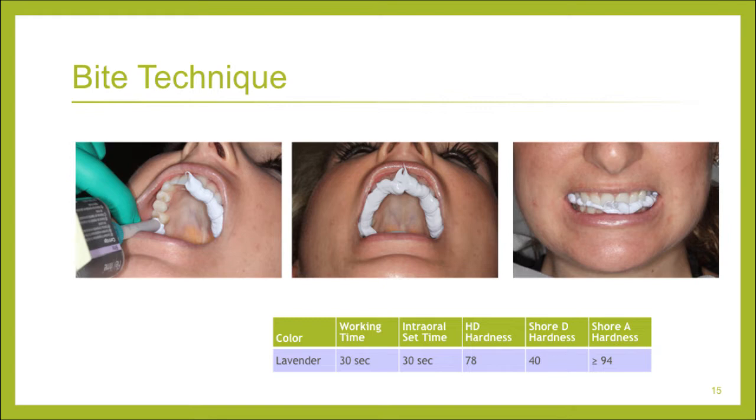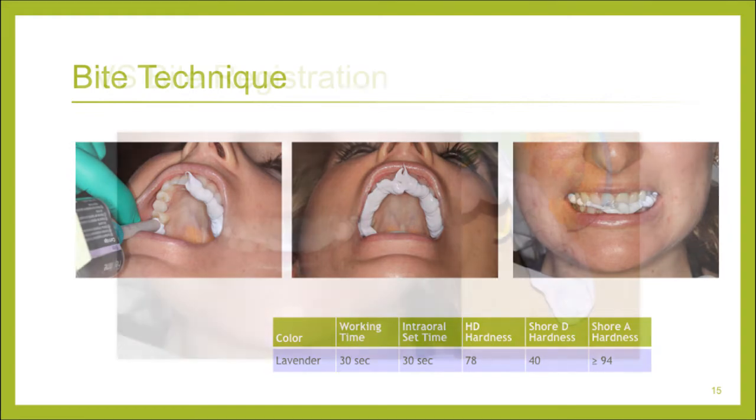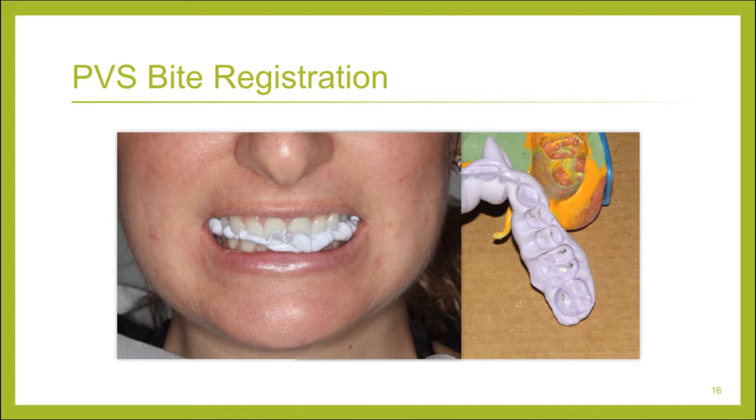And the way that we do this is a little bit different than probably what you've seen before. We'll take the impression, but we're going to start on the maxillary arch. And I learned this from a really good friend of mine, Dr. Cappy Sinclair. He said to me, Shannon, if you take the maxillary bite, place that material, start on the last molar and go to the midline. But again, it's different. Do it on the maxillary arch and have the patient bite together. You won't have as many discrepancies as you would have if you placed it on the lower arch.